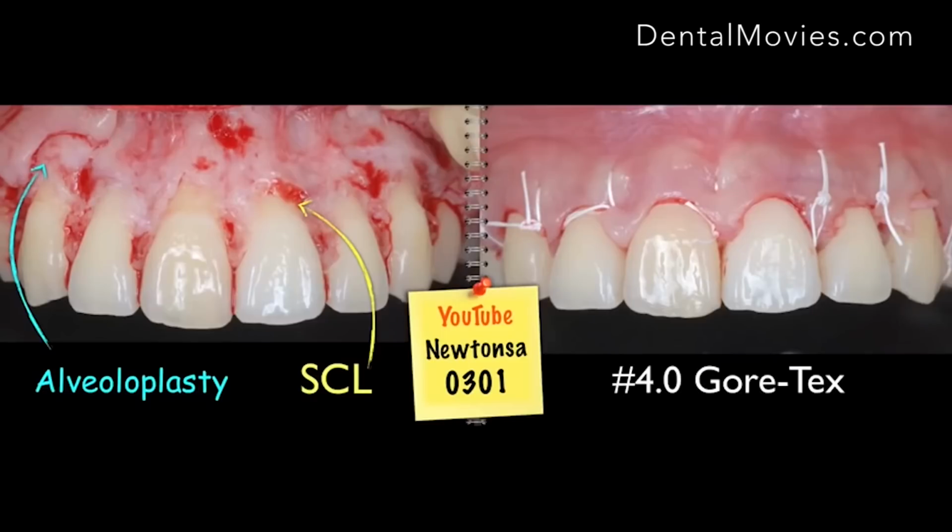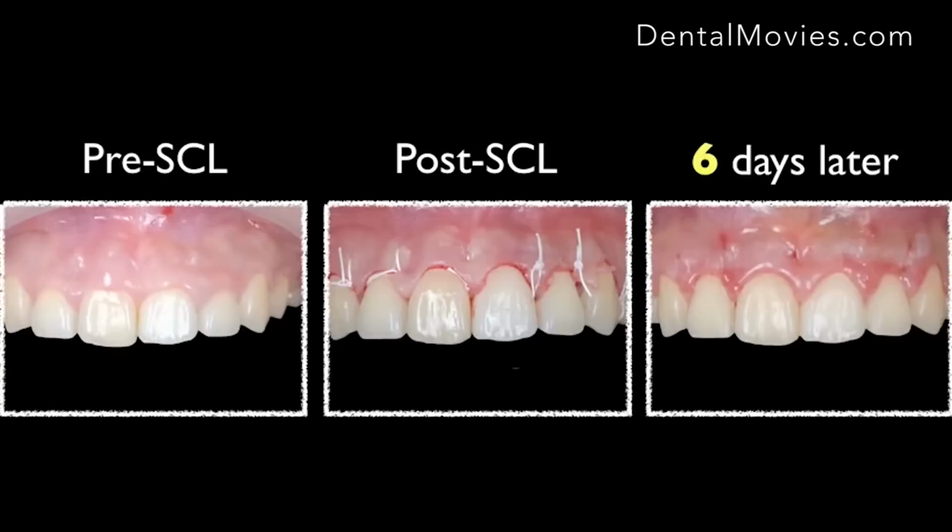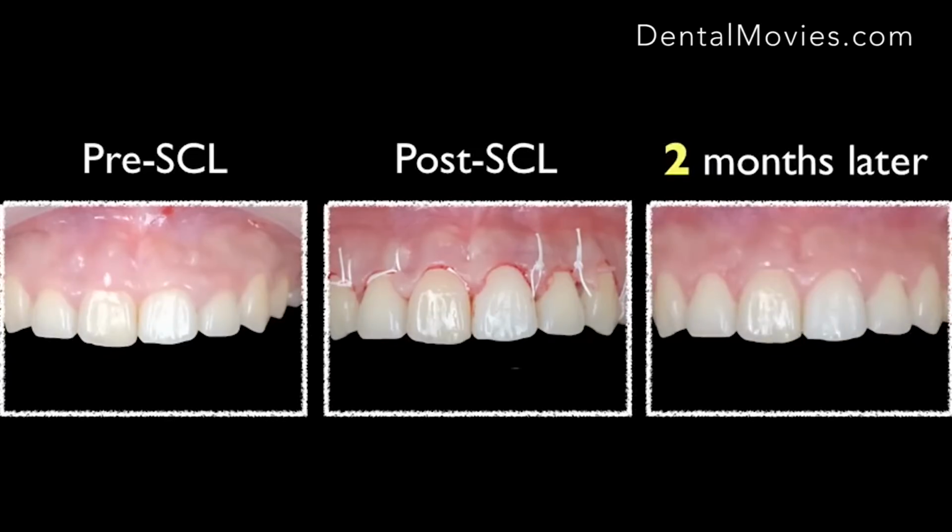Finally, we suture it with 4-0 Gore-Tex. And that's post-surgical crown lengthening. And final evaluation for this case: on the 6th day, we remove the stitches. And 2 months later, the gingival margin stays pretty stable. And look at that crown lengthening effect.